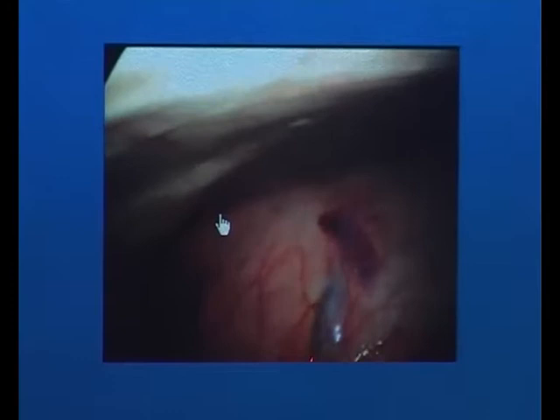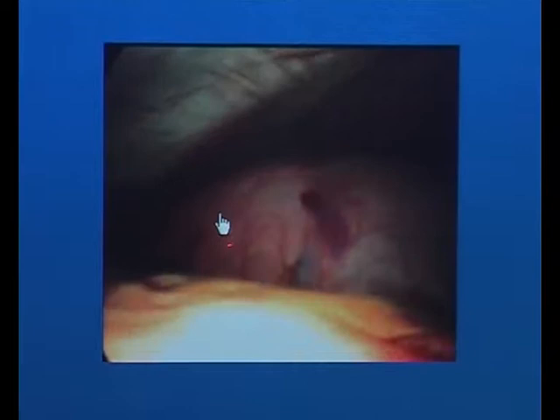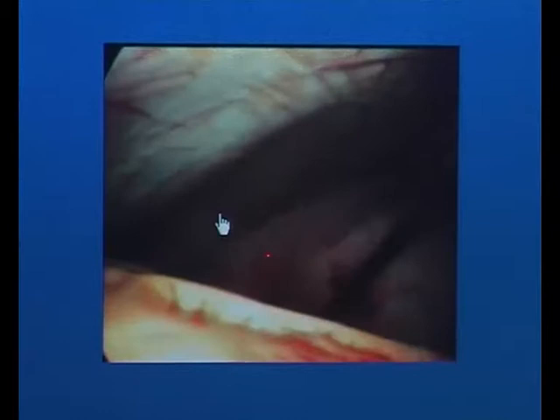But in dorsal recumbency, now you can see the vessels and veins on the net-covered part of the abomasum we have seen before in the standing cow. Now we can fix the abomasum, and we fix it strong, back in the cow near the udder. And here you see the rumen contraction. And now you see the net-covered part of the abomasum. Here's the beginning of the gray surface, and this is the correct position to fix the abomasum.